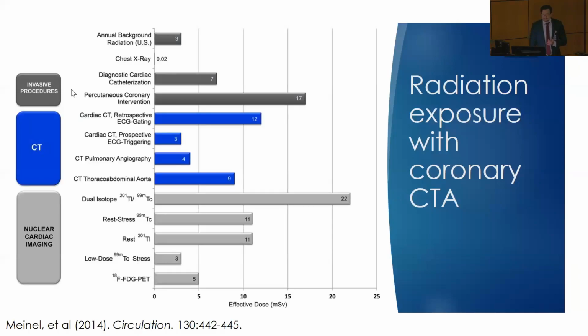The other obstacle to coronary CT is that it's a high resolution CT scan. It blasts you with radiation, just like a nuclear stress test does. But I think that's an important thing to consider, especially if you're going to scan a younger person. Make sure they're aware, like, hey, if you're planning on having a ton of CTs for other reasons, maybe this would not be a great test to do right now in your 30s or your upper 20s.